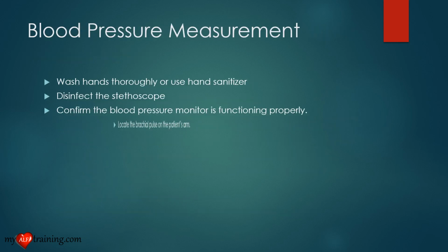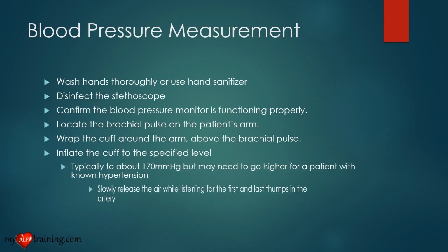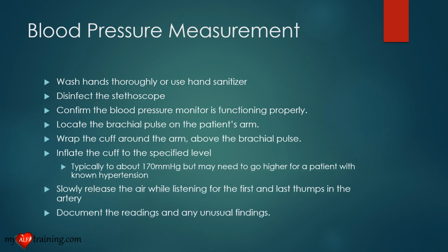Measuring blood pressure. First and foremost, again, we're going to make sure our hands are washed or use hand sanitizer. We're going to disinfect the stethoscope head. And we're going to confirm the blood pressure monitor is functioning properly.